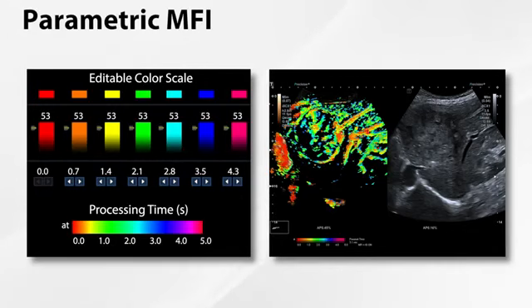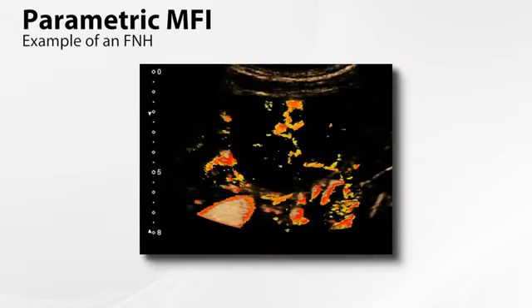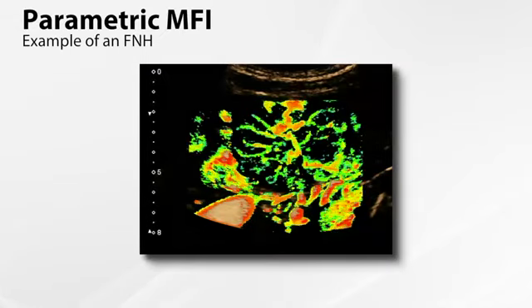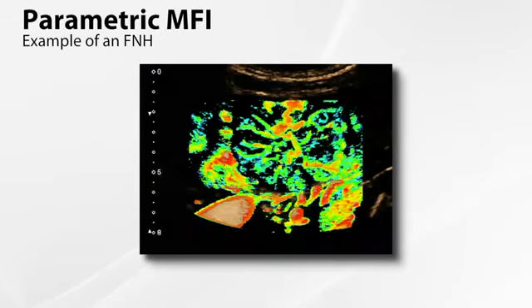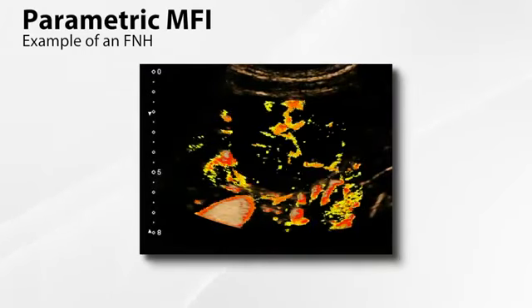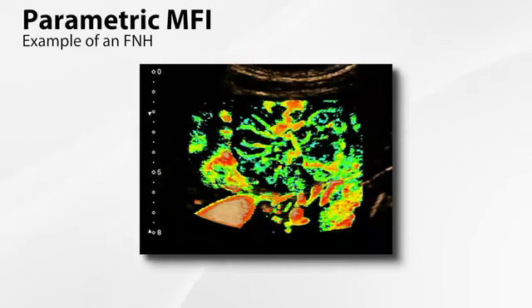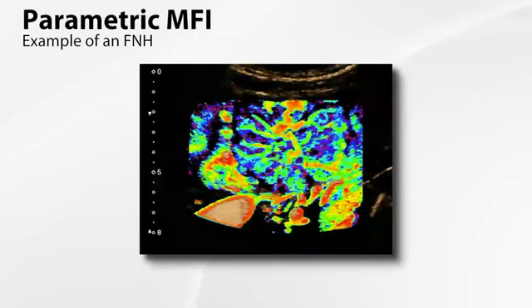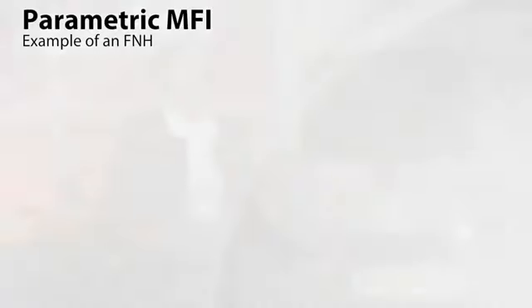This colour coding is editable, giving flexibility in identifying different stages of flow and their timings. Here's an example of an FNH. The delineation of the characteristic spoke wheel pattern is beautifully demonstrated. While this one was chosen to show the feature more clearly, the principle remains the same for those small ones where the vascular pattern can be very hard to see.